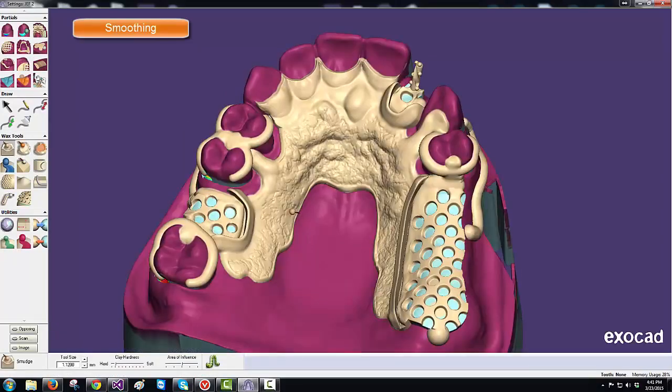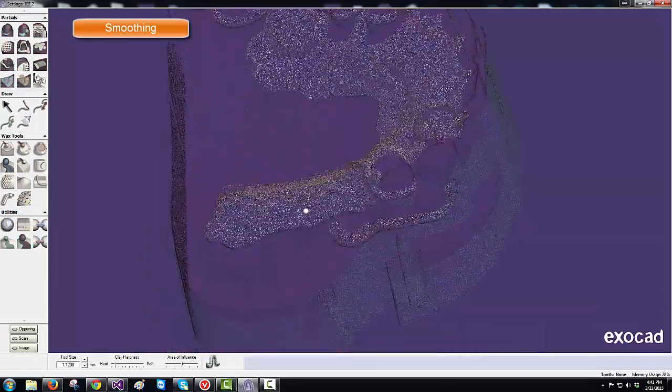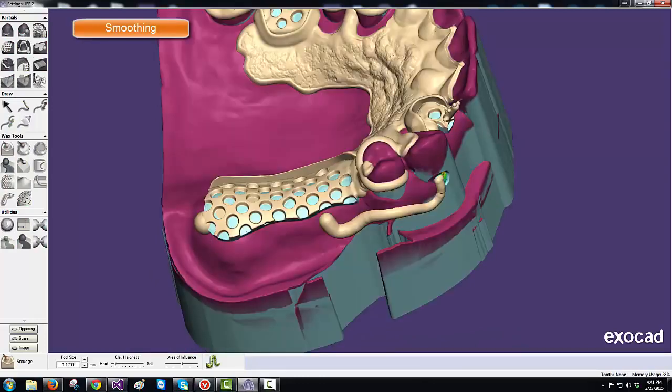And now here I'm going to show you how to connect the I-bar approach arm to the mesh. Using the clone tool, we'll set it up to 1.75 because that's the thickness of the blue relief pad and the mesh. 1.0 plus 0.75. And then I set it to the mesh thickness, which is 0.75. And I create a support path to strengthen that into the mesh, smooth it off, and later we can bulk that up.